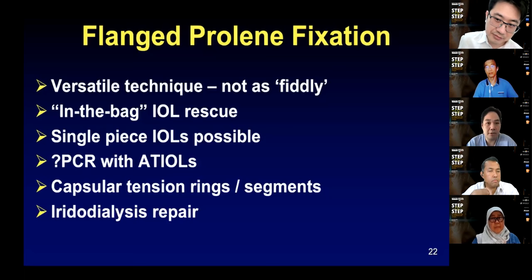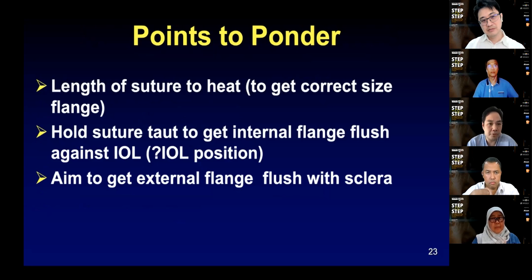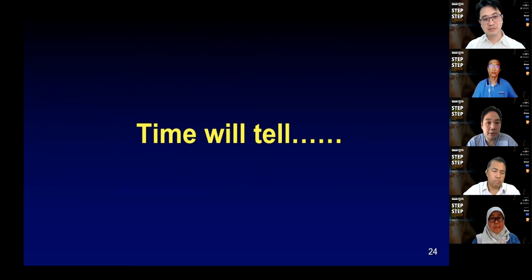So as I mentioned, some points to ponder, as I found in my limited experience so far: the length of suture to heat to get a correct size flange is important, and holding the suture taut to get an internal flange flush against the IOL, particularly in the second case where you actually have just a stopper that's holding the lens rather than lassoing the haptic, which might be more secure. So time will tell whether this will be a good technique. I think it's got a role because it's more versatile, rather than just sutureless fixation, which you definitely need a 3-piece lens for.